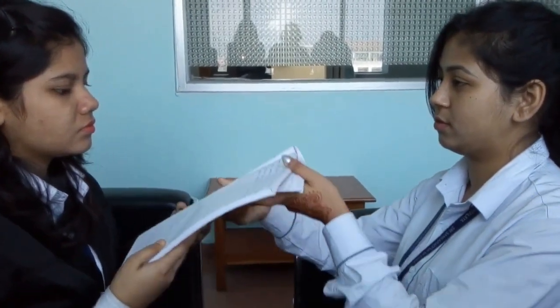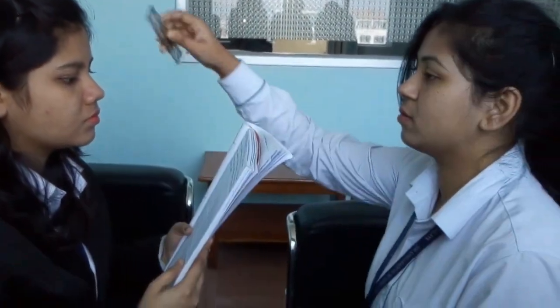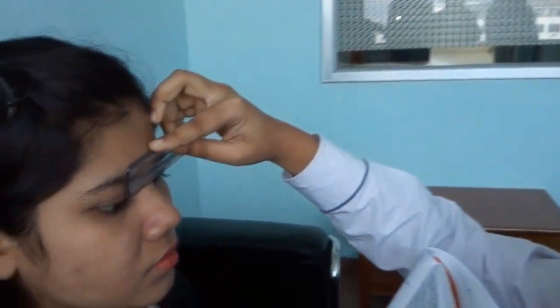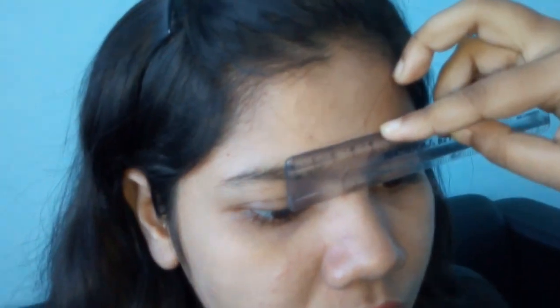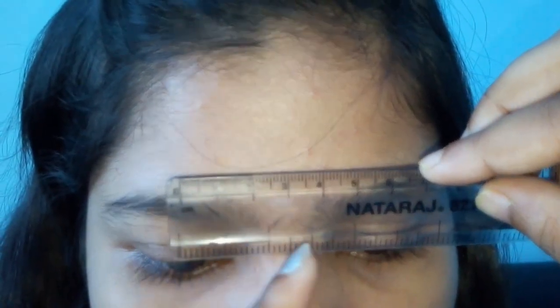The examiner asks the patient to look at a near object. Now, the examiner places the ruler and the measurement is taken from the center of one pupil to the other.